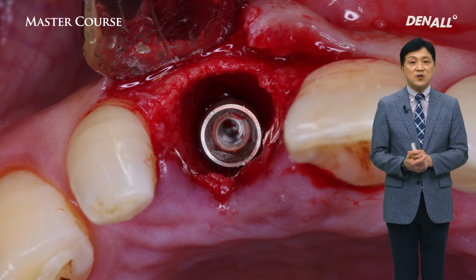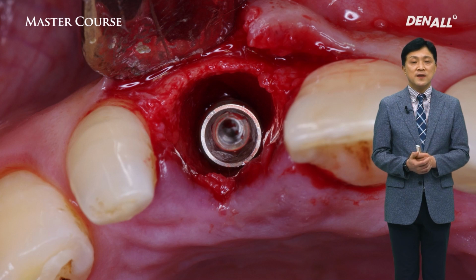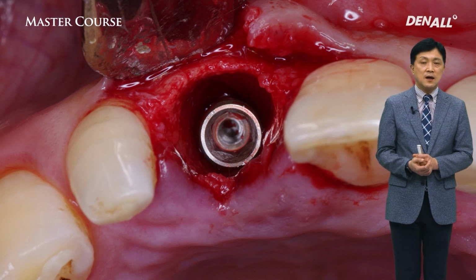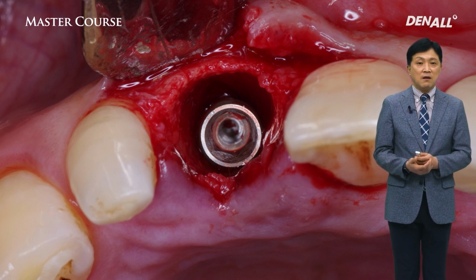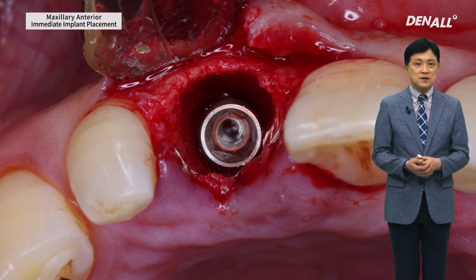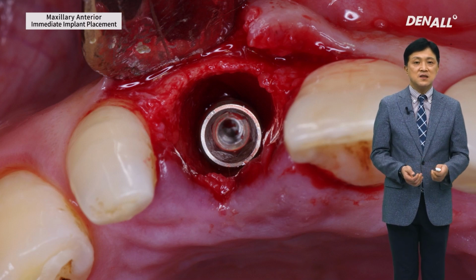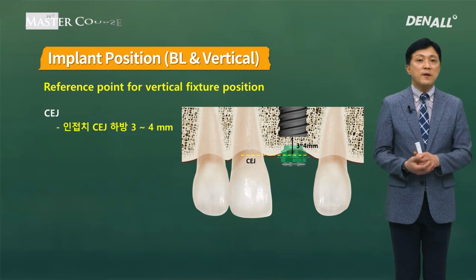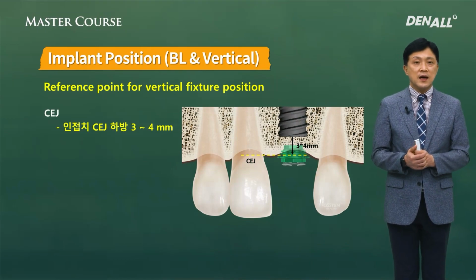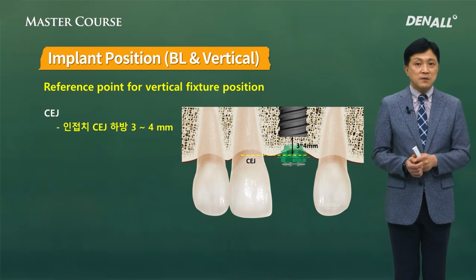Looking at this photo, in this patient, screw-retained prosthesis would be a little hard to make. In this situation, if we correct the path of the implant to position it more palatally, it is very hard to correct the path. I place an implant in this situation. Buccolingually, 4 millimeter gap should be present.